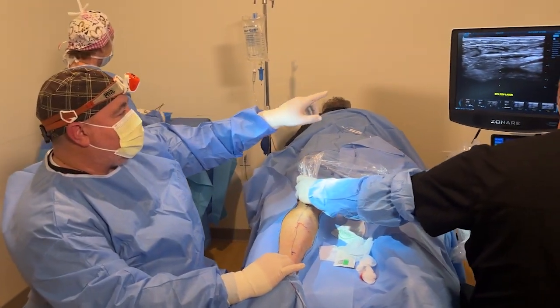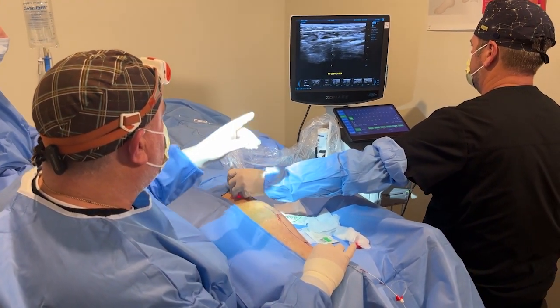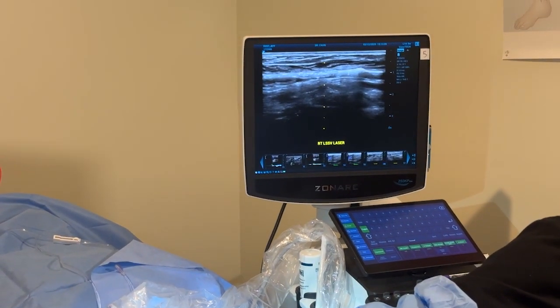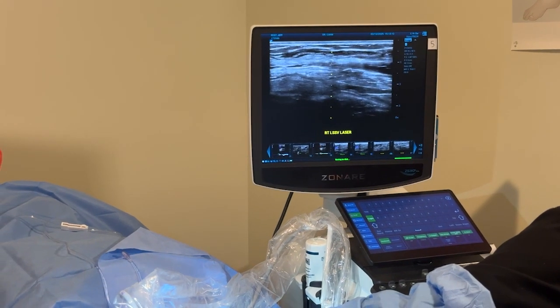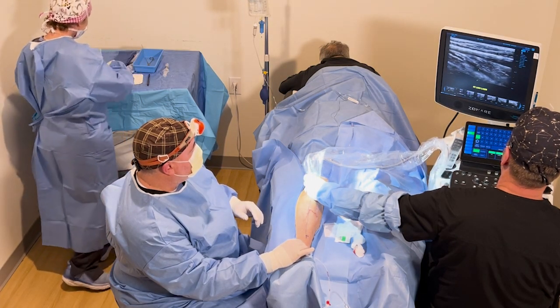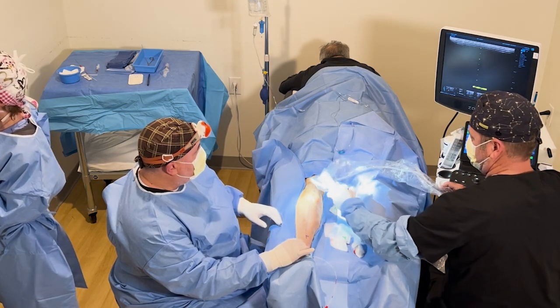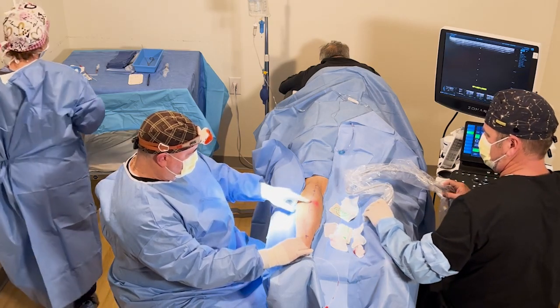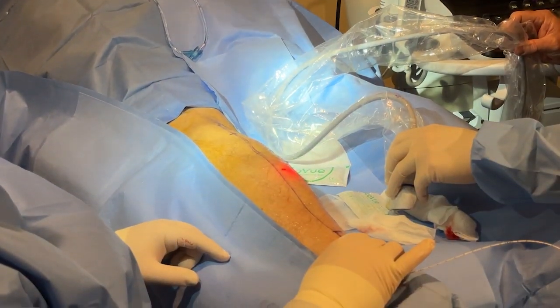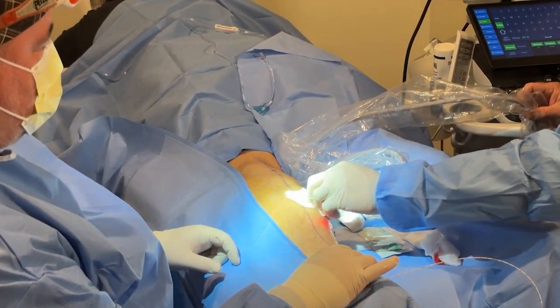Here we go. What you're going to see at the end of that tip is some cloudy-looking stuff inside the vein — that's going to be the heat being generated. You can actually see almost like a smoky pattern, and it's contained inside the vein, so we know we're inside. As we fire it, the heat is being generated, and you can see the patient is perfectly comfortable — no pain, no heat, no burning. Scott continues to keep an eye on the progress of the fiber with the little dot, slowly allowing that heat to generate inside the vein and damage it. When we put his compression stockings on after, his vein should seal, and eventually over the next 12 to 18 months, the body will absorb the whole thing.